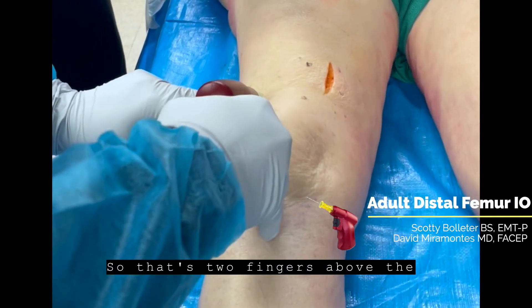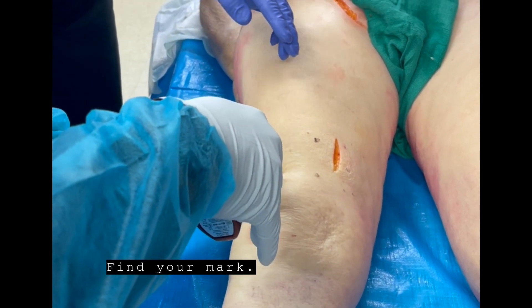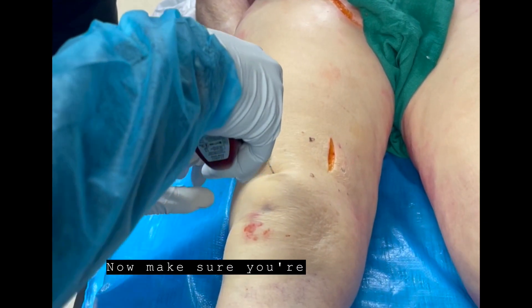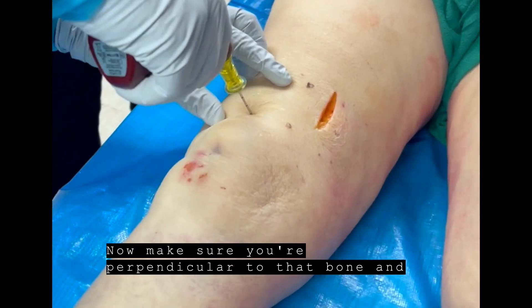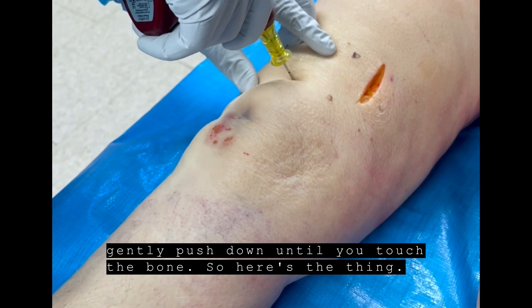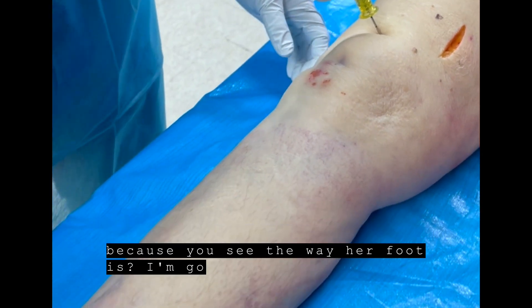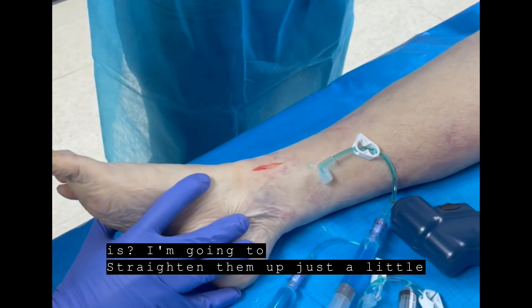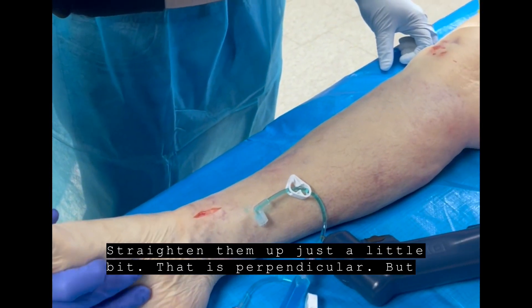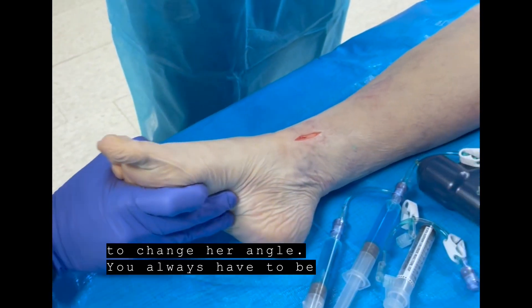So that's two fingers above the top of the patella. You're finding your spot in the midline. Find your mark. Now make sure you're perpendicular in that bone. Gently push down until you touch the bone. So you have to be mindful of the position of your patient's leg — you see the way your foot is? I'm going to straighten him up just a little bit. That is perpendicular. But if she were posturing, you have to change your angle — you always have to be perpendicular with the bone.